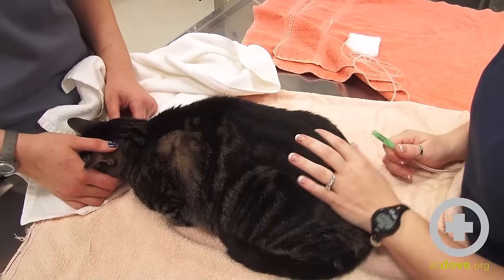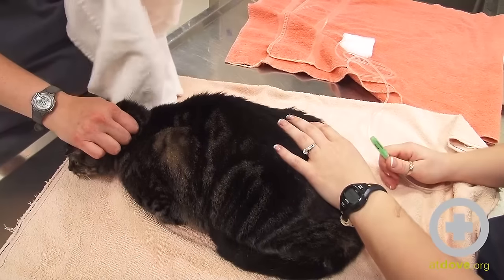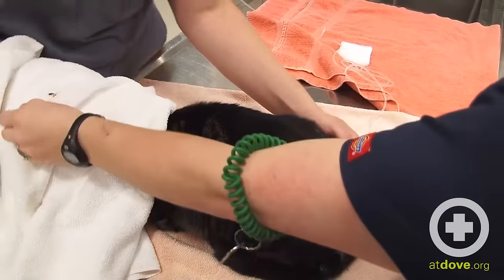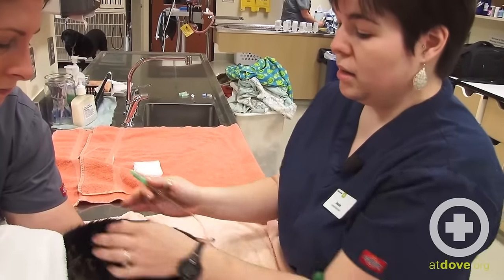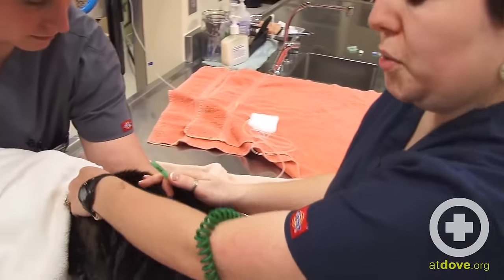Since this kitty is a little bit nervous, we're going to use a towel to cover his head and make him a little bit more comfortable. Sometimes with more anxious animals, or at home, you can burrito wrap the patient in a towel if it makes them more comfortable. Just make sure you're still able to access the area in between the shoulder blades.